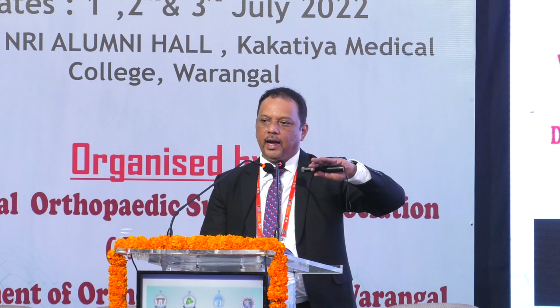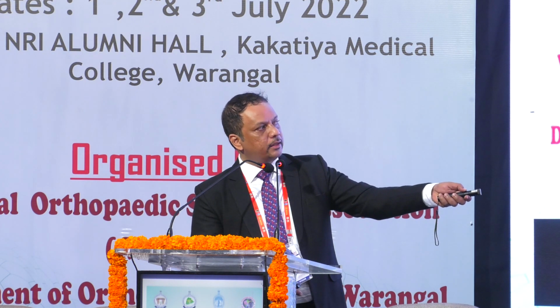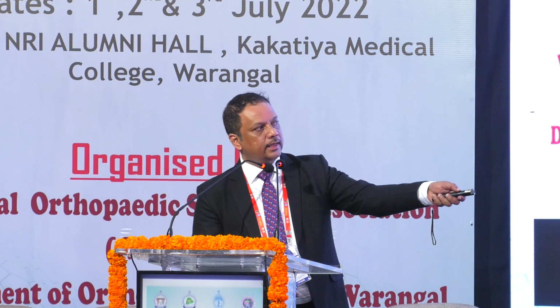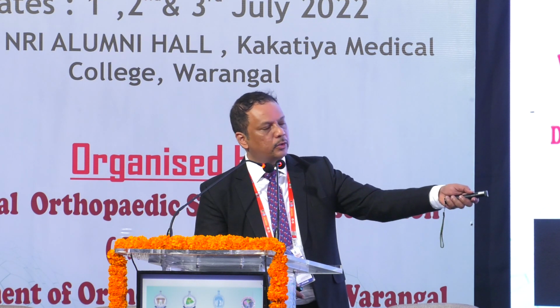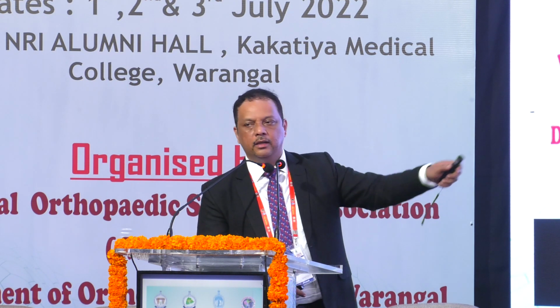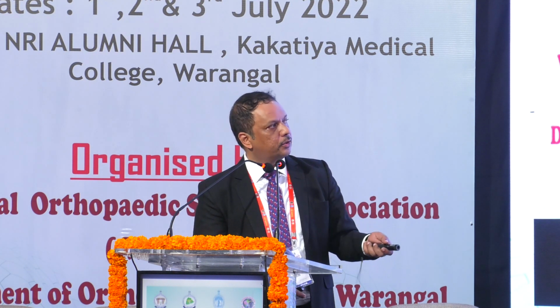So always go till the radial side and take off the brachioradialis. That is the culprit there. Once you take away the brachioradialis here, it nicely comes back at this point. We normally don't expose so much here. We always feel scared about going very radially, but that is really worth going there.